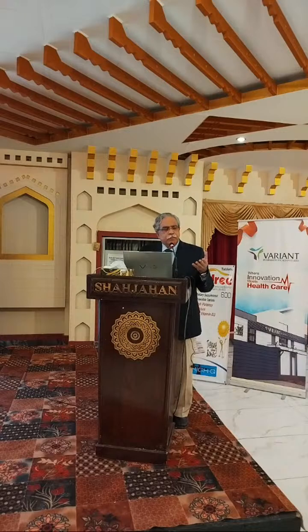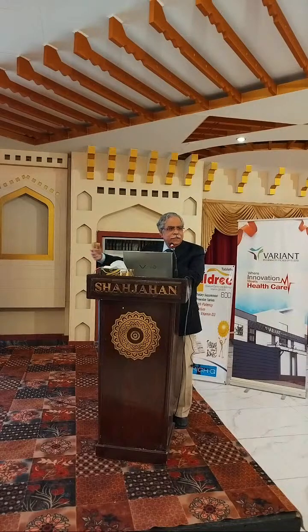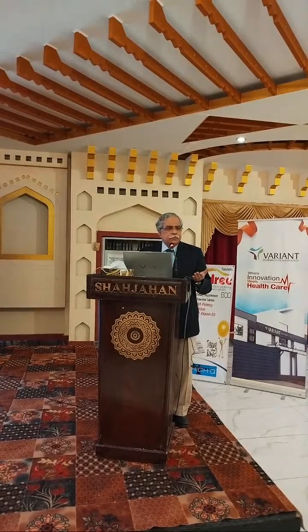If the vascular bed is distal to where you are examining, you need to look at the diastolic phase. So if the vascular bed comes after where you are examining, you need to look at the characteristics of the spectrum towards the end of the spectrum. So if it's a high resistance vascular bed, your diastolic flow will come down, and eventually your diastolic flow will reduce, and in even worse cases, your diastolic flow will become reversed. And if there is a low vascular resistance distal to where you are examining, then your diastolic flow will increase.